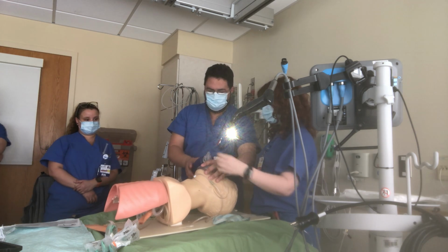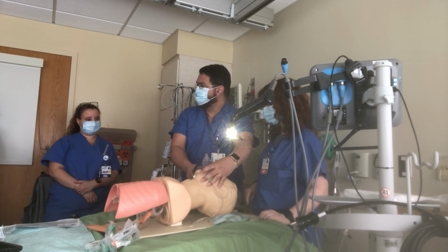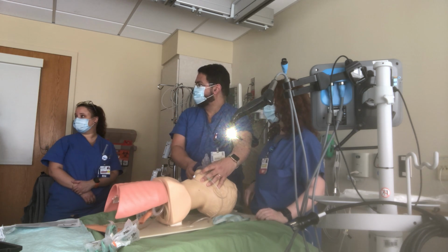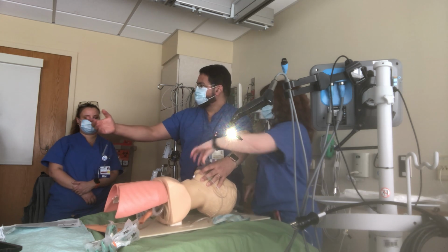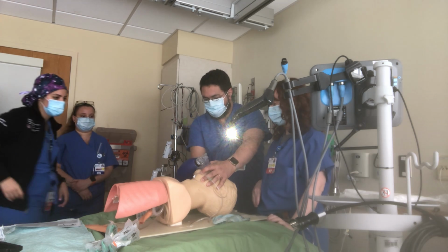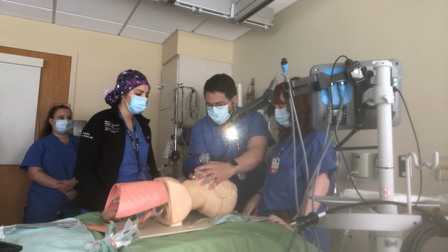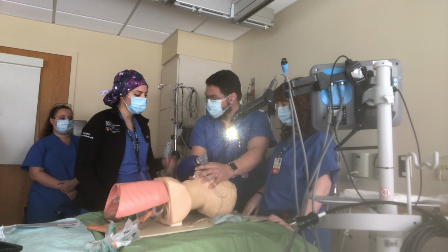Right, I'm trying my best. What are you gonna do, Amina? I'm gonna correct your position. You still have somebody else, so you're gonna come here. And I'm gonna hold with two hands. They call it the two-person technique. So now I can improve my seal, and you ventilate.